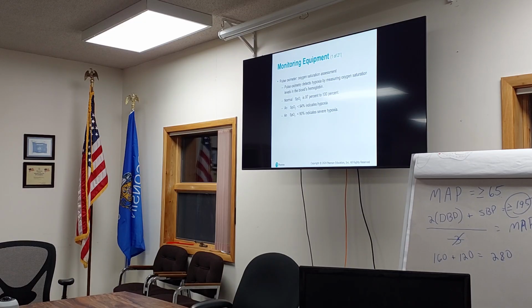Ideally, we want our patients to be better than 94%. 94% or better. 96 is fine. Doesn't have to be 100%. Okay. In fact, right now, if I checked everyone in this room, we're probably going to see 95. Any smokers? Smokers might be a little lower. Yeah, but as long as you're better than 94%.